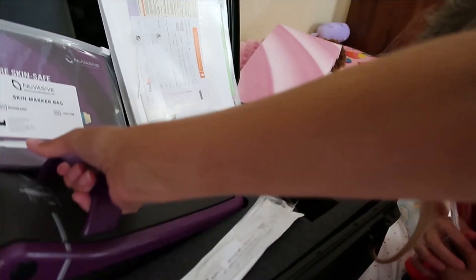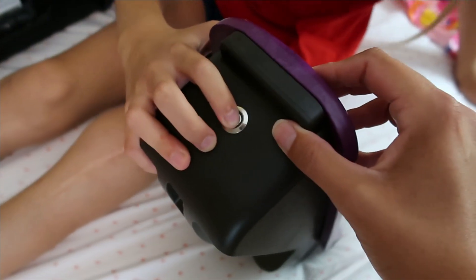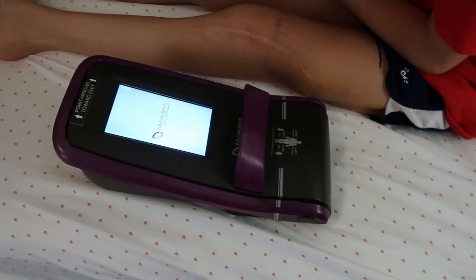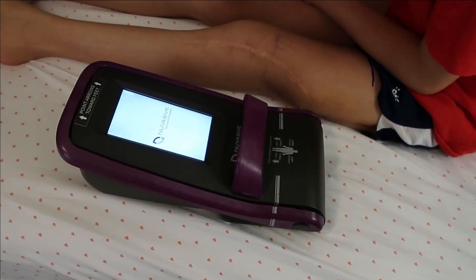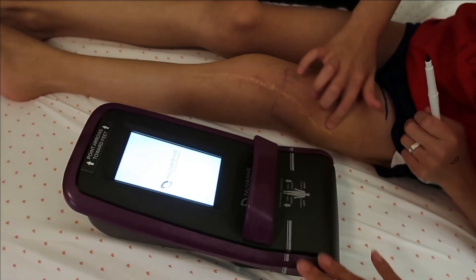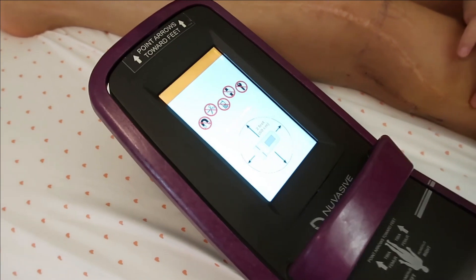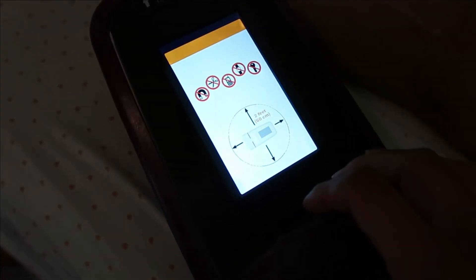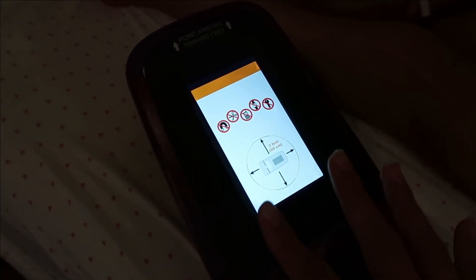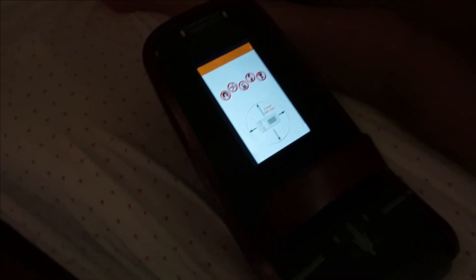So here's the device. I asked them, what if this breaks down? What do we do, because we'll be in Michigan eventually. They said that we call them, they will be able to access our settings, get a new one set up exactly to our settings, and overnight it to us wherever we are living — which I thought was pretty cool. It's an Android machine. Keep it away from all metals, cell phones, magnets. You definitely don't want it around magnets. This is a magnetic machine, but it can really mess with pacemakers and all that.